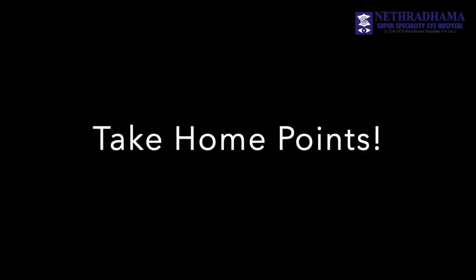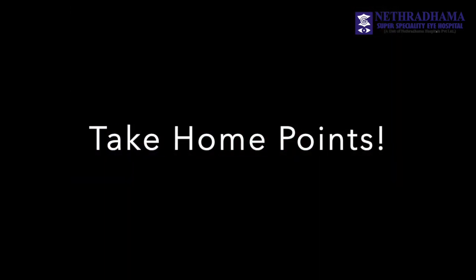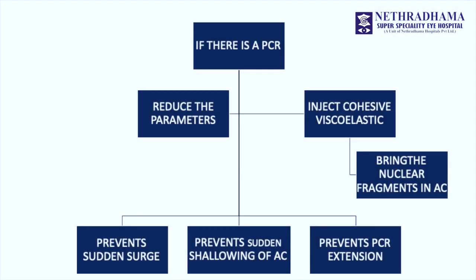Some take-home points from this video: when you are removing the last fragment, it is better to reduce the flow rate and vacuum so that there is no sudden surge and upthrust of the PC — this will prevent a PCR. You can also stop, put in some viscoelastic before removing the last piece, bring it into the anterior chamber, and emulsify it there.